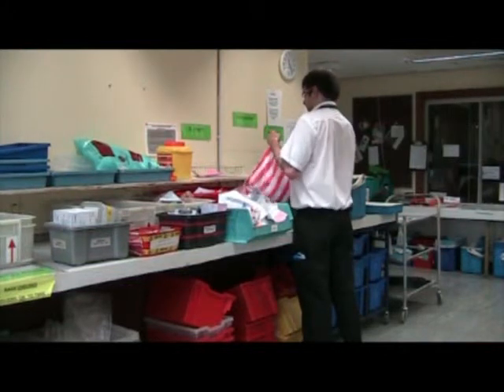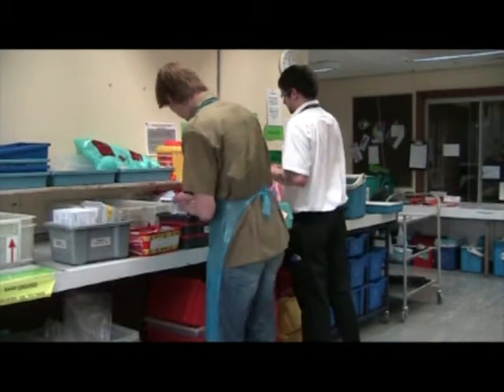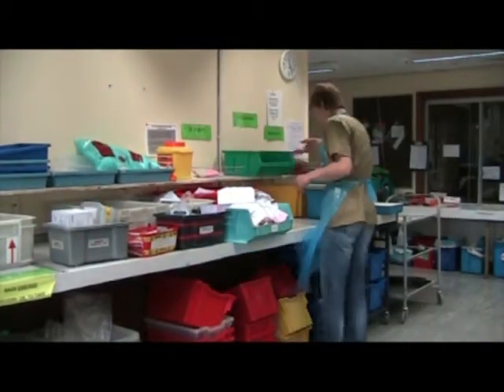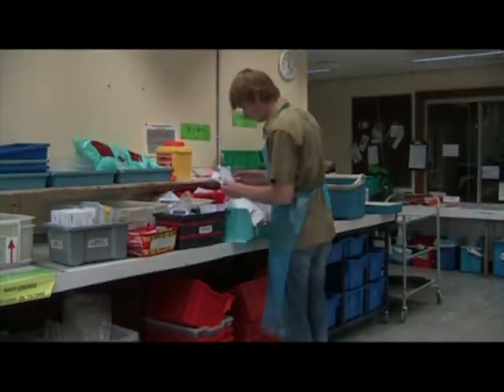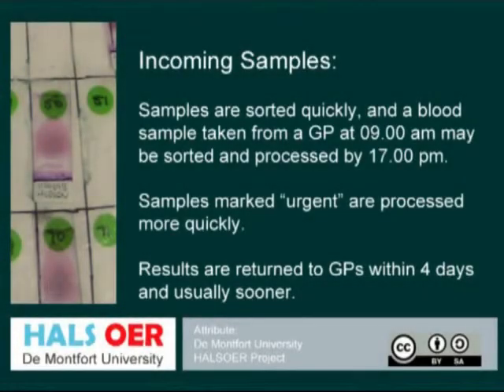And I think that's what you have to emphasize. We've got three hospitals here, and we also get samples that arrive from other hospitals. At this moment of time, it's relatively quiet, but about 2:30, it will get really, really busy where the GP samples will arrive. They will come in these white kegs or boxes, and they will be marked from whatever surgery they've come from.